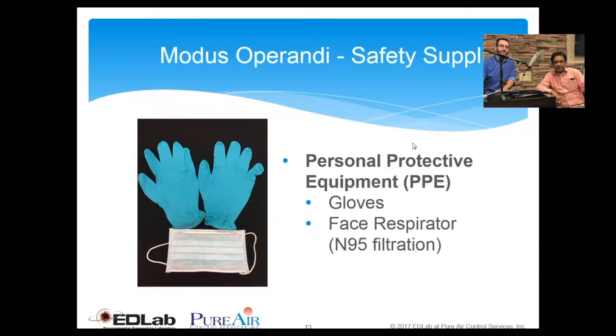All right. Should you wear anything specific when sampling? That's a very great question, Ronnie. As I said earlier, you never know. These are environmental samples, and many times people are doing this in a proactive or reactive manner. So sometimes you have no clue whether the sample you are collecting has Legionella or other pathogenic bacteria in it.